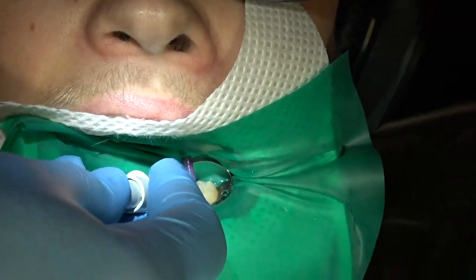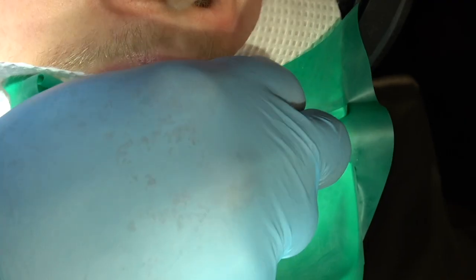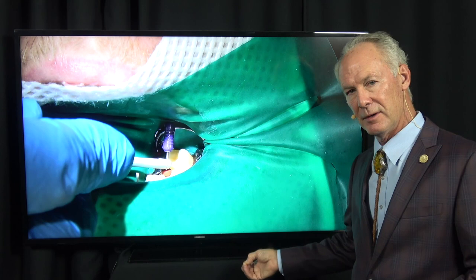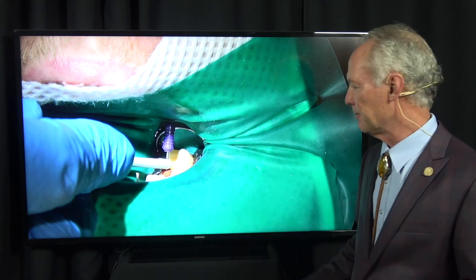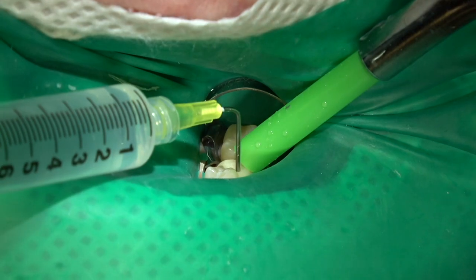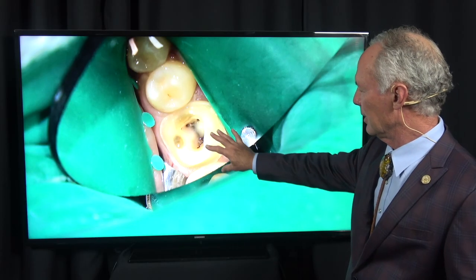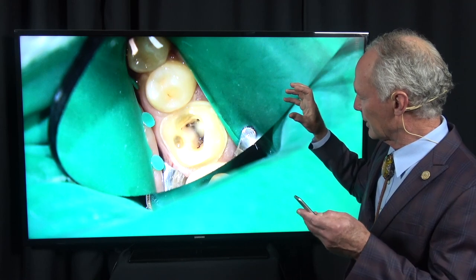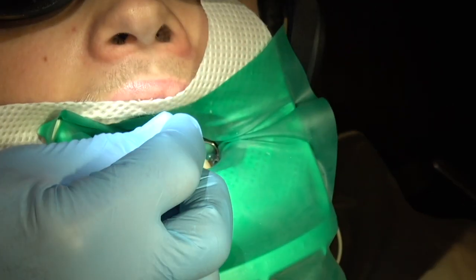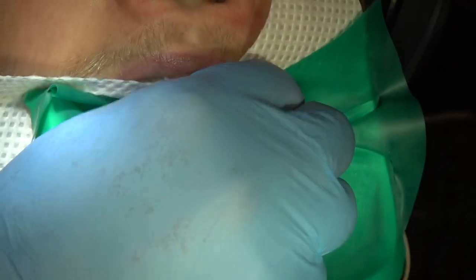And this is the mesial buccal. And it also is at 1 millimeter, 1 millimeter from the apex. So you'd like to be a half millimeter from the apex. So I need to go a little bit deeper or further into the tooth. And so this is the mesiolingual canal, and it's also a millimeter from the apex. So that's good. I'm going to open up the coronal part of the canals a little bit more and then go a little bit further into the canals, file until I go a half millimeter deeper into the canal.